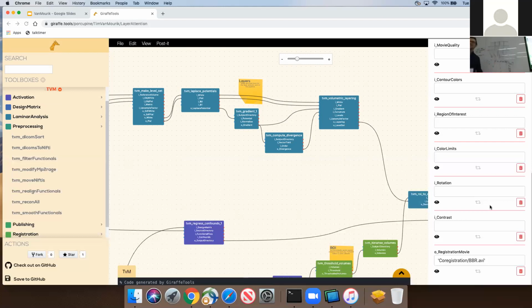But in the presence of noise, this inversion gives rise to artifacts that may be so problematic that the results can hardly be trusted.